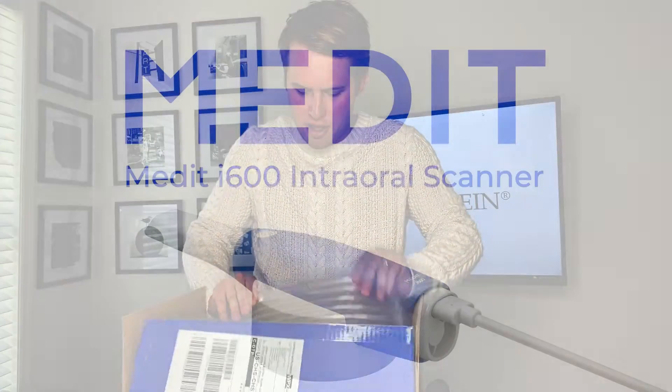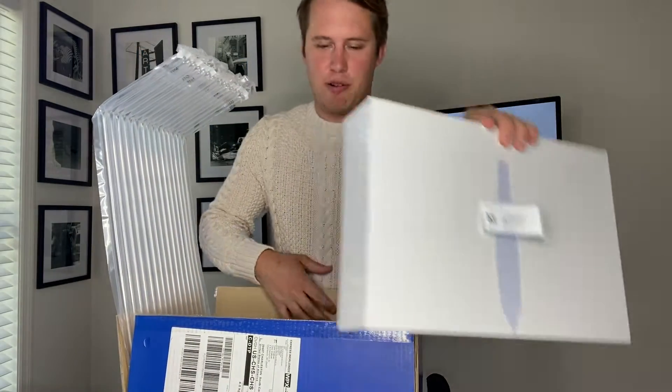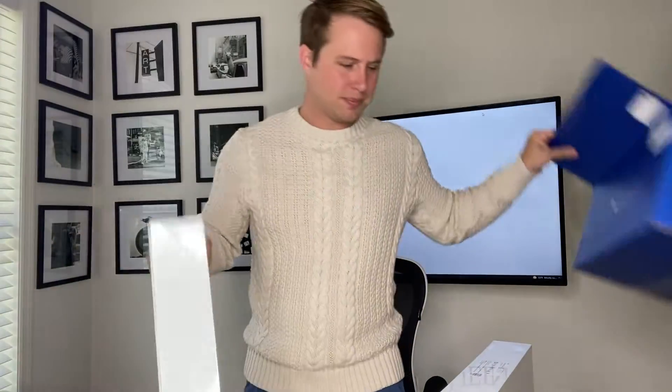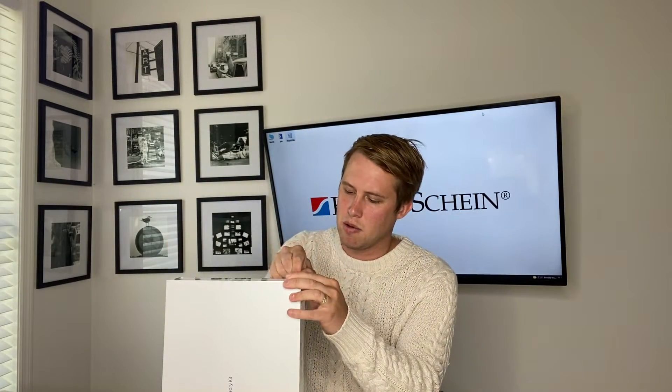I'm excited - I just received the new i600 scanner. We're going to unbox it to see what's inside. The i600 box is packaged very well, along with the accessory kit. Let's open them up and see what we have in the accessory box. Clean, all-white packaging.